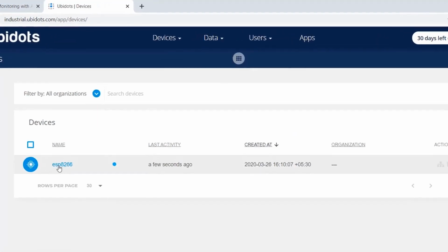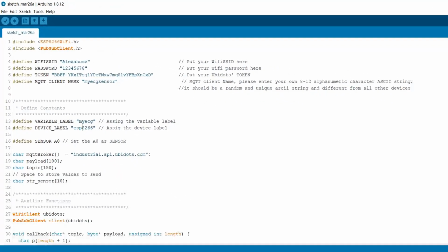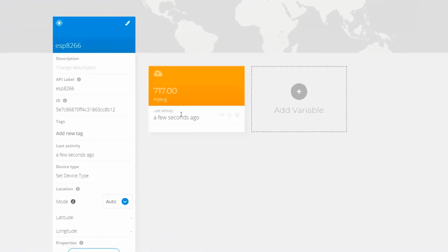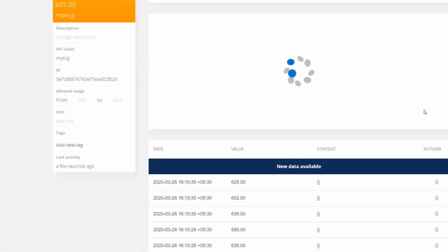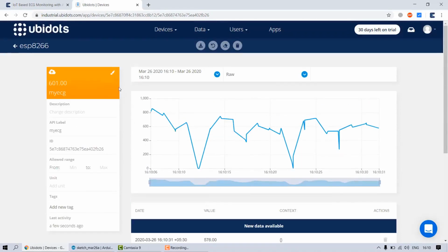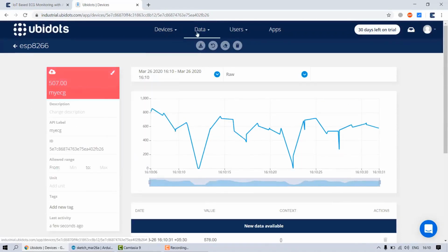So you'll get the device name as ESP8266. Now remember, this device has come automatically from the code that you uploaded. And this variable called myECG is also generated from the code. So just click here, and you can see the entry of the last data and the current data with the waveform above and below. You can just change the color of the graph, whatever you want.